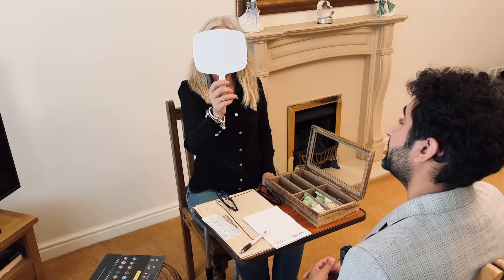Now the second pair's got a little bit of colour to it on the sides. This is the model lady, light blue fade colour. Look at that one. I like that shape as well. The shapes are both very similar — they're both deep frames, but I think the colour's better with those. Can I just try those ones on again? I feel a little bit lighter in white as well. I'll probably go — I'd go for those ones. That's my recommendation. So we've got two pairs of readers and a pair we're going to use for sunglasses.